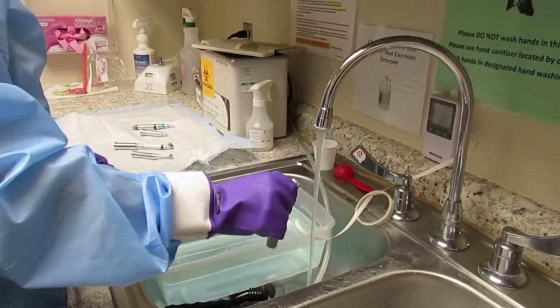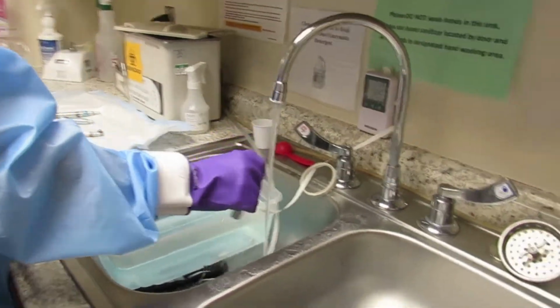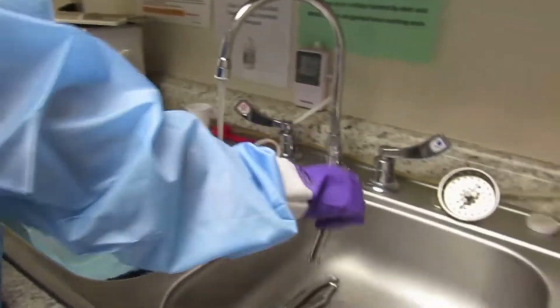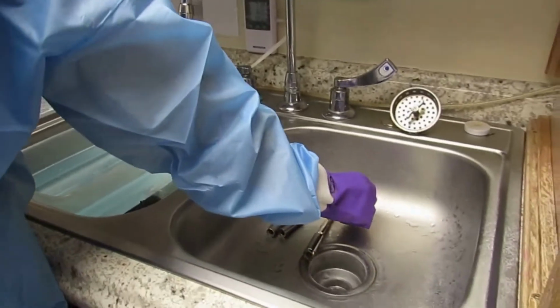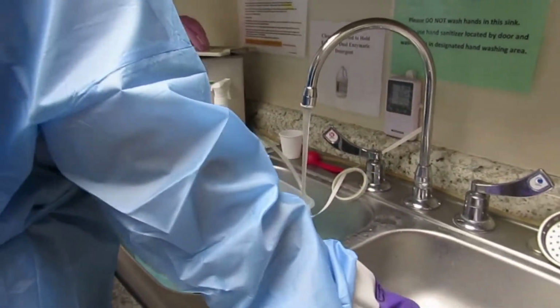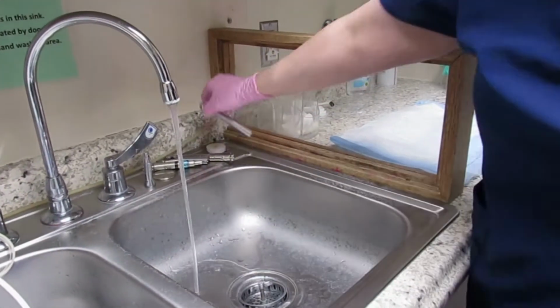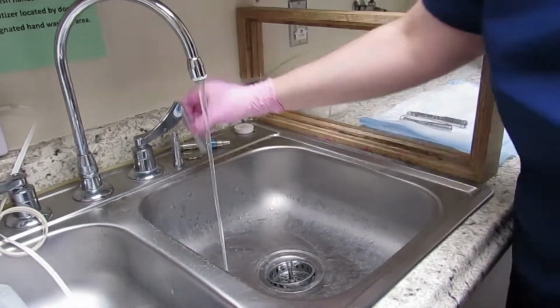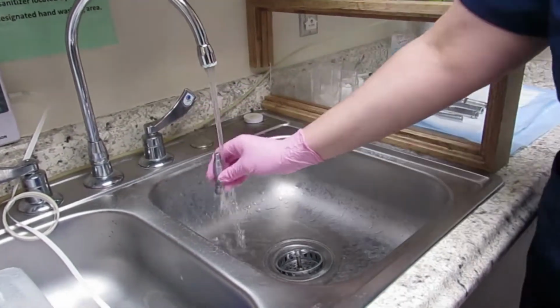Once the handpieces have been rinsed, place them into the second bay. Again, remember to avoid water entering the connection ends of the handpieces. When transitioning to the clean side, the handpieces are given a second rinse. Then we start the lubrication process.